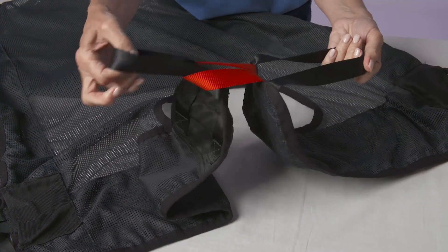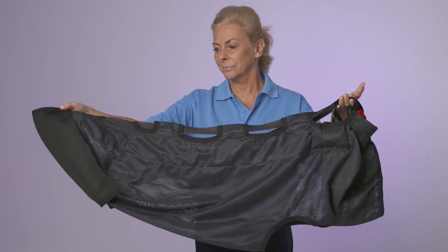A combination of design and fabric choice ensure the sling is secure, durable and extremely light.